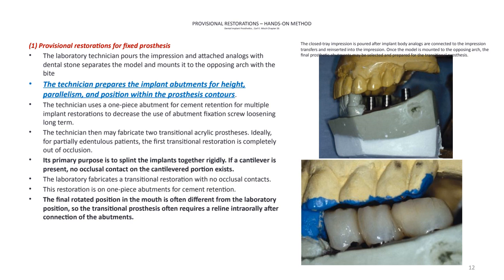So in general, for the temporary restoration for implant cases, it's recommended to be done off occlusion or with very light contact on the occlusal surfaces. In general, when we're talking about multiple implants, we want to do a provisional restoration that is splinted. So they're all joined, which gives a little more strength to the restoration. And also it fits better over the abutments. Okay.